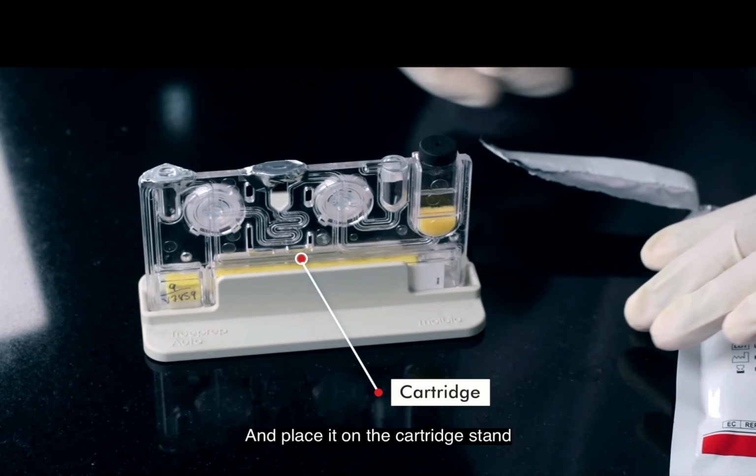Sometimes if you carefully notice on that yellow color sponge, there will be a pink dot. Okay, so that is actually a processing control, an internal processing control. So when you add the sample, that control will also get extracted. It will also go through all the steps your sample is undergoing, and this particular control is added so that you know the DNA extraction has occurred. The problem, if any occurs, is in the DNA extraction.